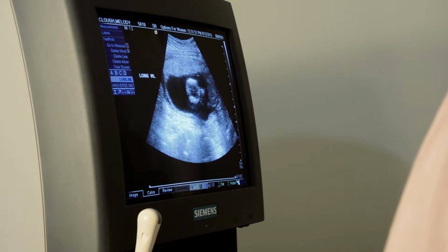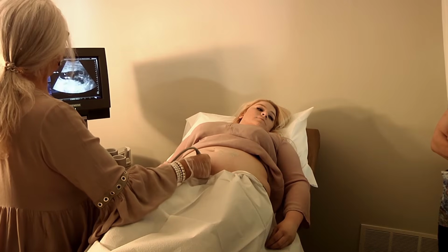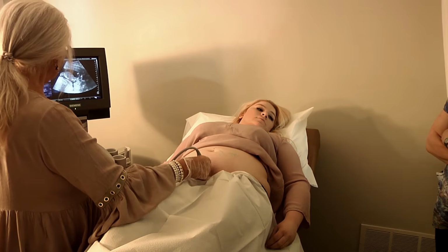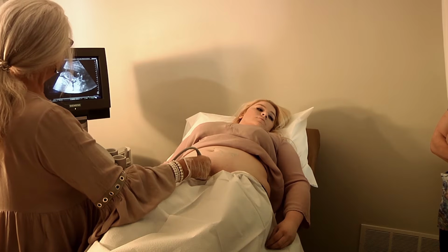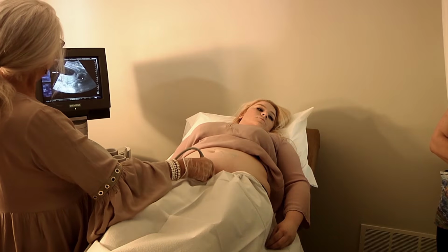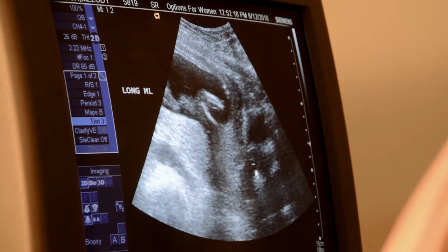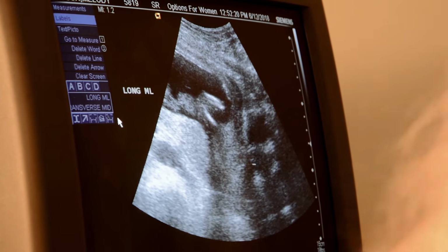And right here is the placenta. And here is the fundus, and here's part of the baby's face. And then you'd go back and then take a lower. I'm going to go ahead and let you guys do it. I'm just showing you what you'll be doing. And then here is the lower uterine segment. And here's her bladder and vaginal canal and cervix. Freeze that, and that would be sag midline lower.